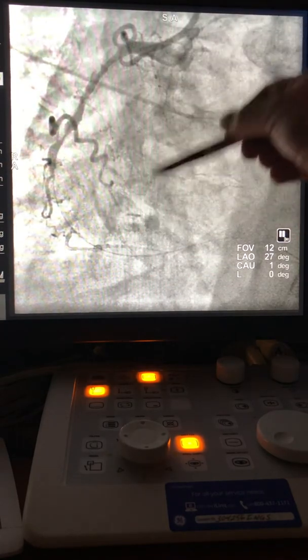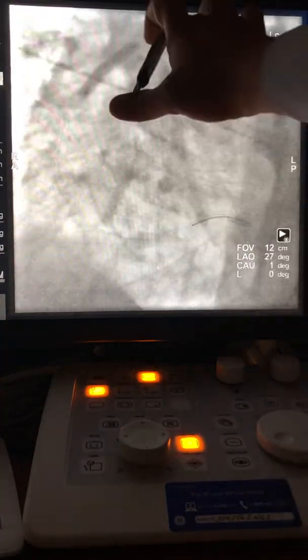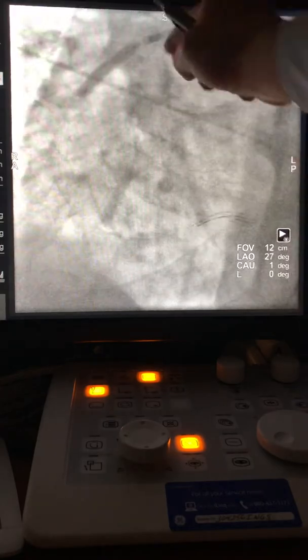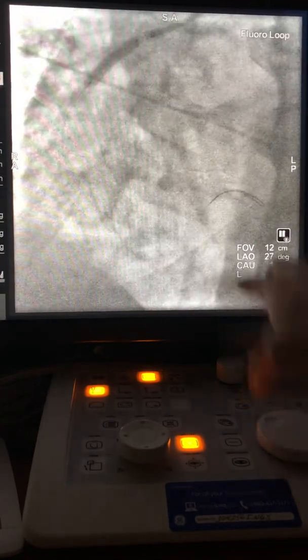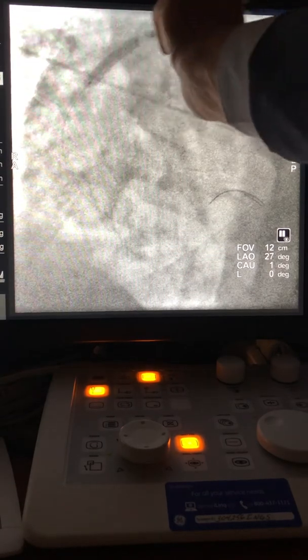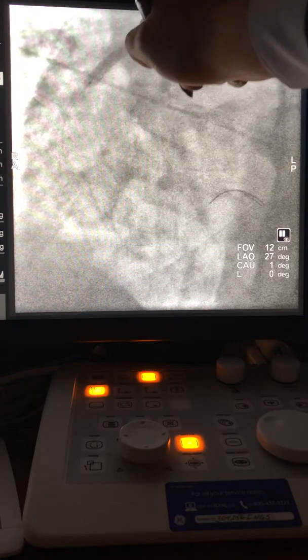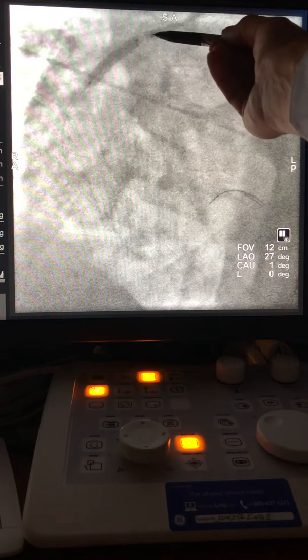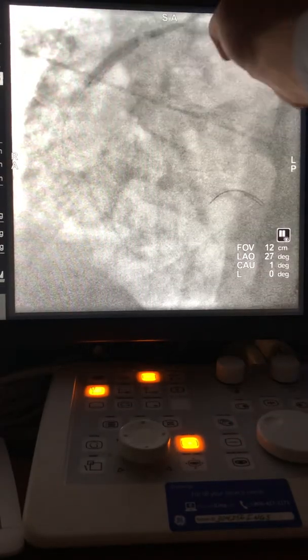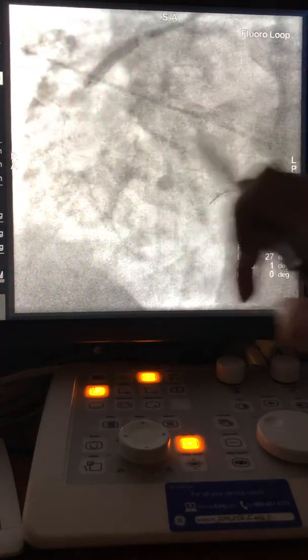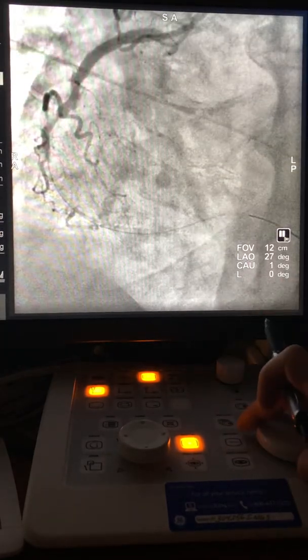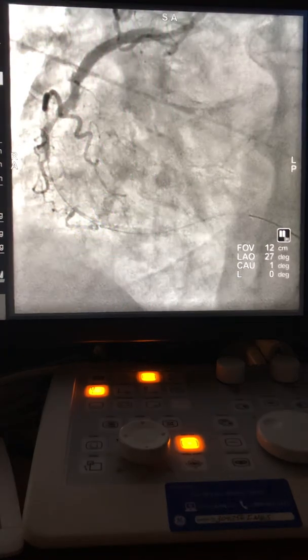Advance the guide liner again, fix from here to here, seal the area, then put the guide liner on this fat segment and balloon first. This is the tip of the guide liner. Once you balloon and put the stent in that area, before you pull the balloon, deflate and advance the guide liner over the balloon. Do not pull the balloon without advancing the guide liner, otherwise the guide liner tip will get stuck on the struts. Deflate, pull a little bit, advance the guide liner over the balloon, and place it here. Now this area is sealed and it is safe for the guide liner to be here.